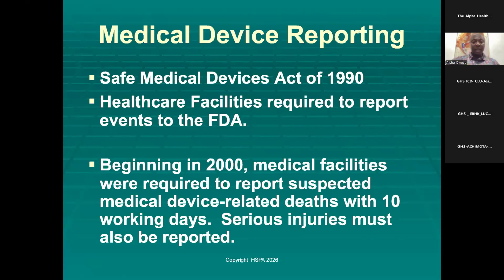If you suspect that a medical device is not working properly, I've been in other facilities where you see right away that this medical device is not working correctly. But because the technicians don't know that this is class 1, this is class 2, this is class 3, even if it is not functioning properly, they are not able to report because they don't have anything to substantiate that.